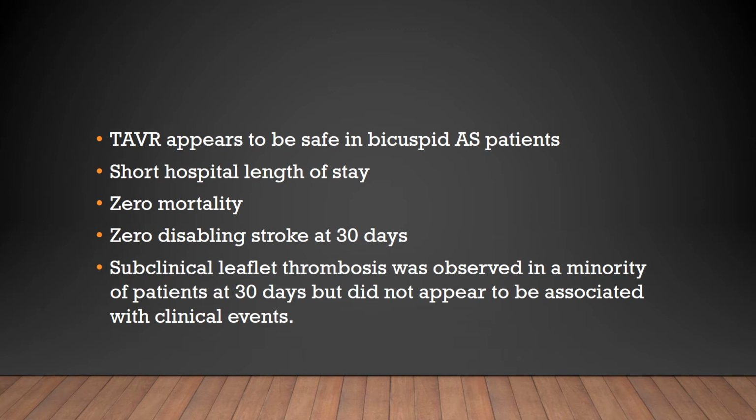Subclinical leaflet thrombosis was observed in a minority of patients and did not appear to be any different than other cohorts, which is actually good, because one of the concerns that we as operators have is that if the valve is not going to be opening symmetrically, and it's going to be more constrained, and the leaflets are not going to have as good of an excursion, would there be more leaflet thrombosis, which thankfully was not the case. So this is good news for TAVR in bicuspid aortic stenosis.